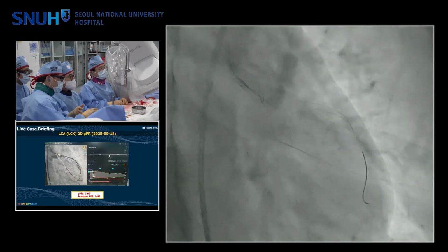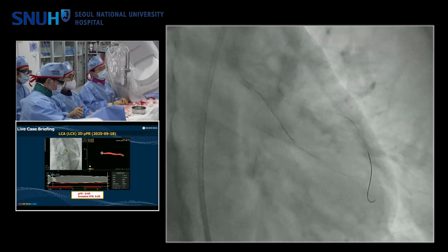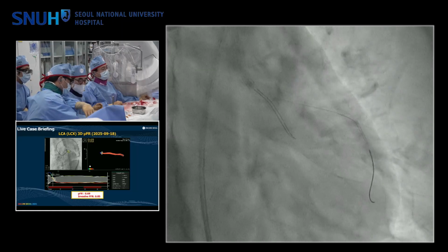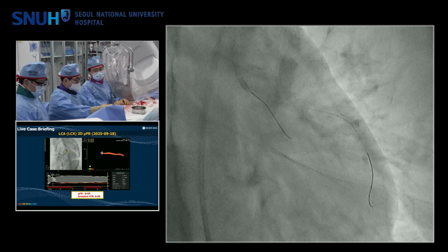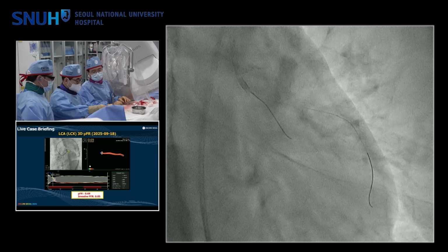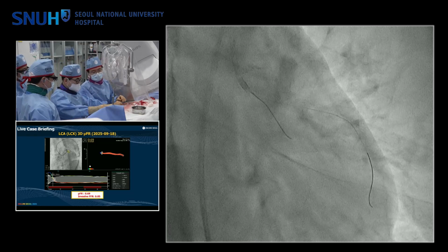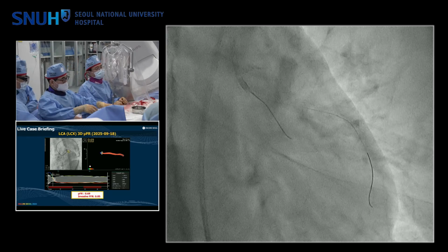How's it in Japan? So we can use mu FR, however, only diagnostic. Simultaneous usage for the mu FR and PCI is not covered by insurance. Oh, I see. For the diagnostic UFR is covered by insurance? Yes. Oh. So you actually get an extra pay with the MUFR. Oh yes. In Taiwan, it's complimentary. I mean, free of charge.